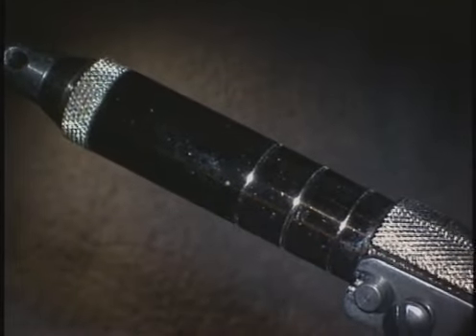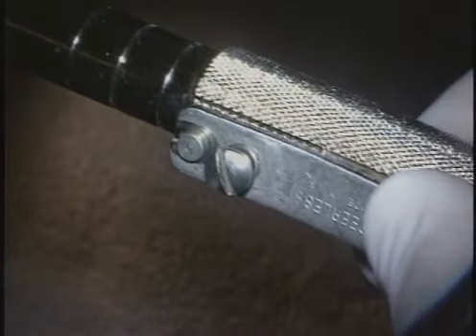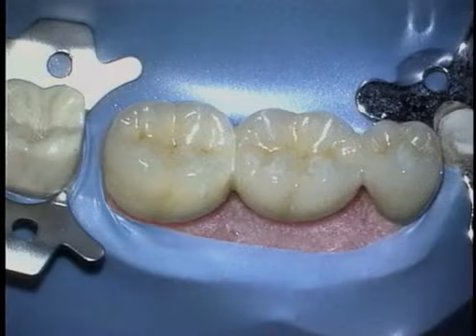Three rings represent progressively increasing power intensities and can be selected by pushing the distal end of the instrument proximally. By compressing the trigger, the insert tip is activated and moves 1/2 millimeter.